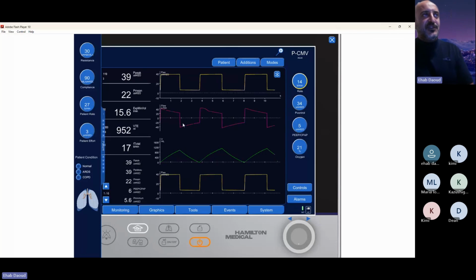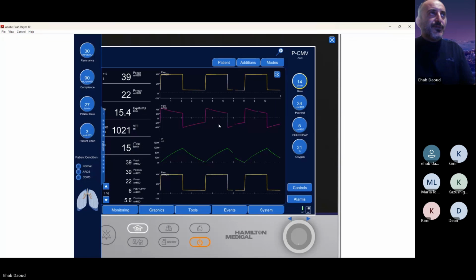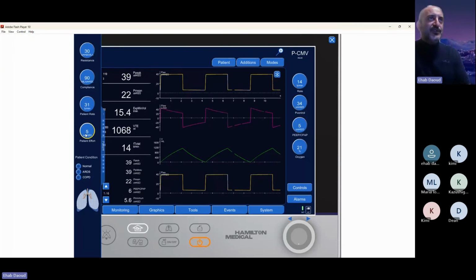Let's just give it 1 second here, because you will see a bump during the flow, but there's no trigger after it. Again, the asynchrony simulator online is sometimes hard to match.